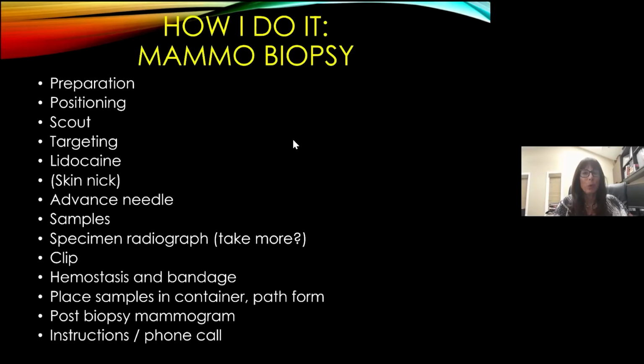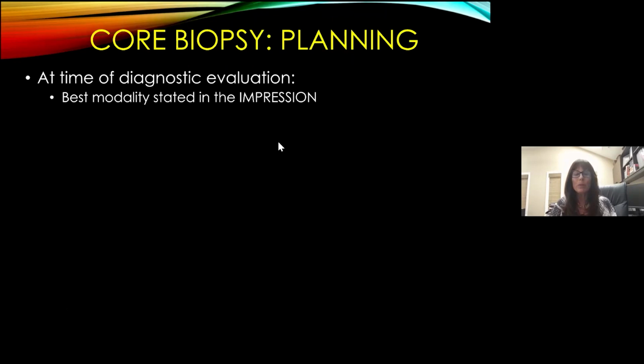I'd like to go through one case to show from beginning to end how I approach these biopsies. So we're putting everything together right now. One of the most important things is planning before the procedure is ever done. The first step is going to be at the time of the diagnostic evaluation, when the radiologist should specifically mention which modality is recommended.